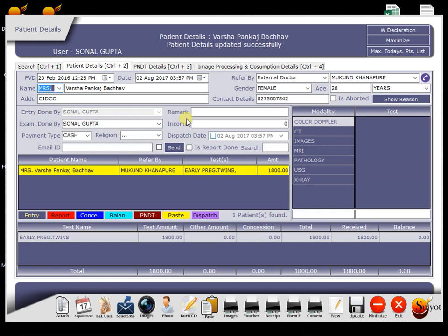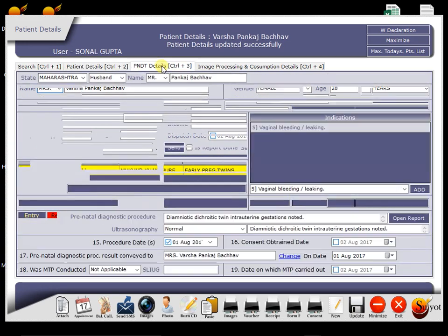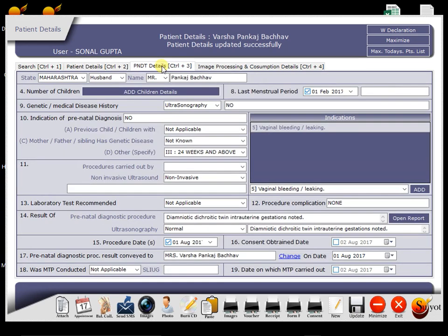But for the obstetric patient, we also take other info from the patient like her previous child details, her LMP. So to enter that info, we have to open third tab that is PNDT details by clicking on it.